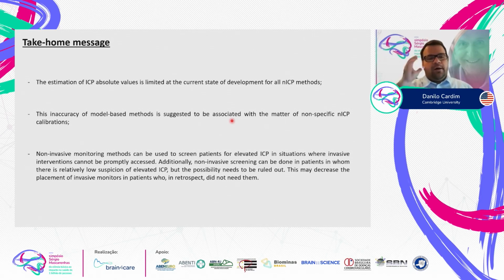But overall, as we know also from the literature, non-invasive monitoring methods can be used to screen patients, for example, for identification of intracranial hypertension, or, as the Brain4Care method provides, to detect impairments of intracranial compliance in situations where invasive interventions cannot be promptly accessed, or are even forbidden in certain clinical situations.